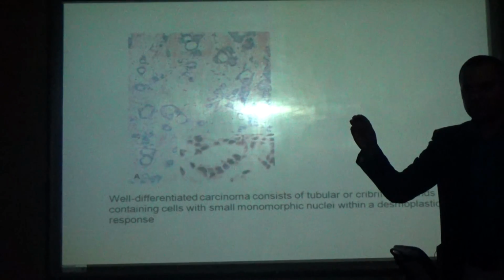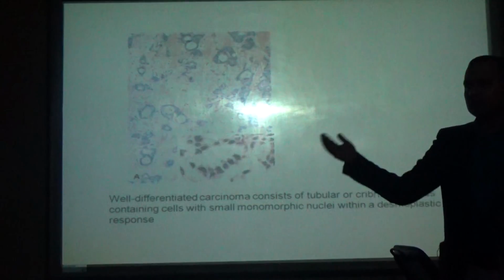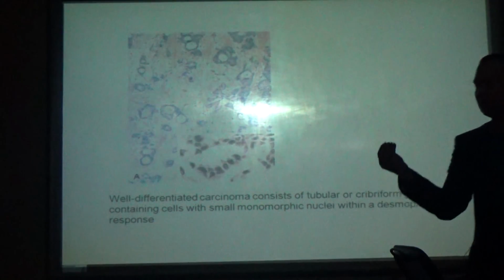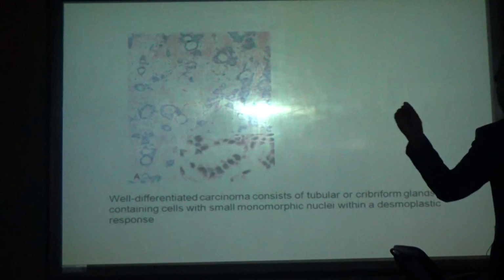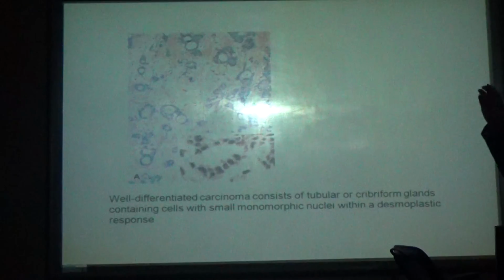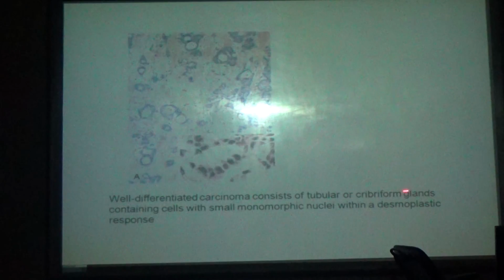You have seen mosquito nets? To prevent mosquitoes from entering the house, we will have mosquito nets. Same like that, we call it a cribriform pattern, a small round netted structure, right? The tumor will present the same way, small and rounded. We will call it a cribriform pattern. This is one small. Okay, fine. These are the tumor cells. This is a high-power view of these cells.